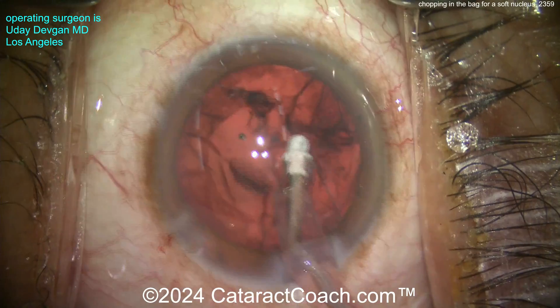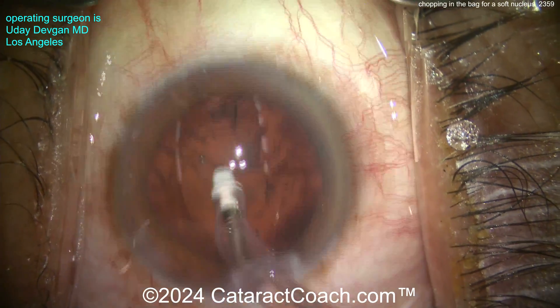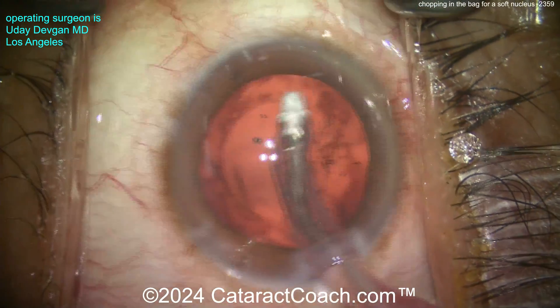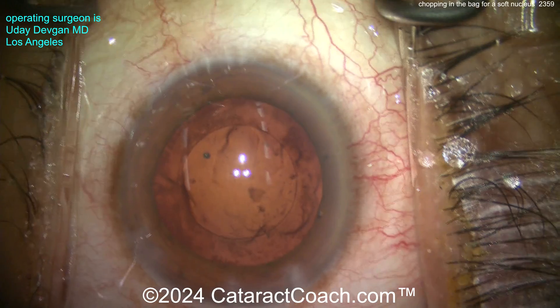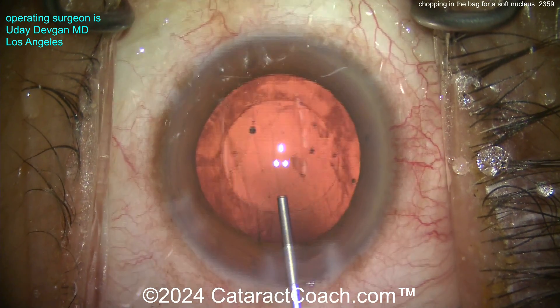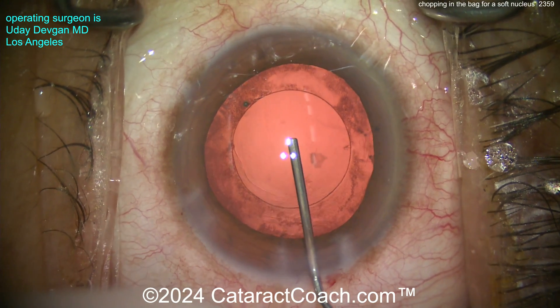Cortex removal — cleaning that up. I just want to show you: you want to have a lot of different skills in your repertoire. You want to be able to do a chop in the bag, a flip and chop, or any other technique. Stop and chop is great too, divide and conquer — I want you to learn all of it. Have all the techniques down and then decide which one to use for which case.